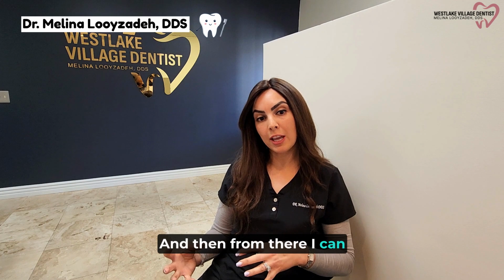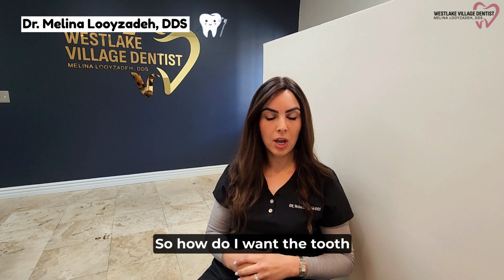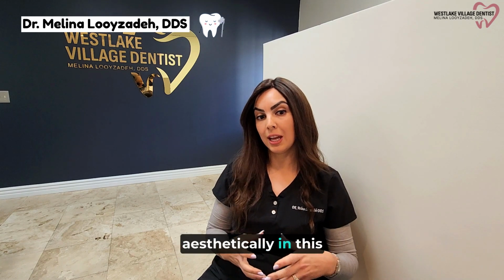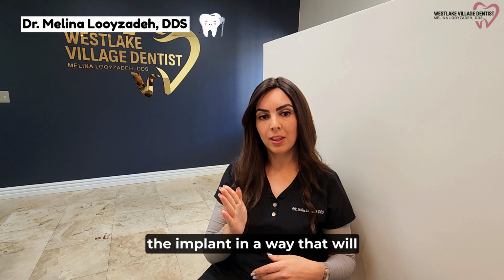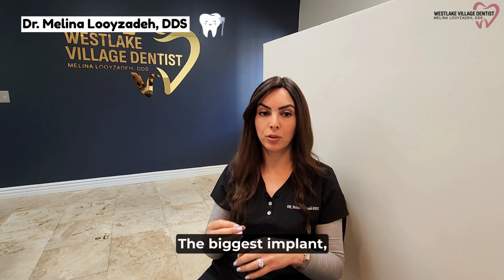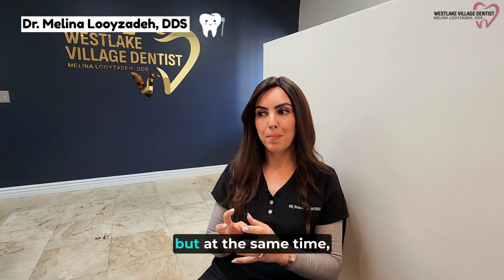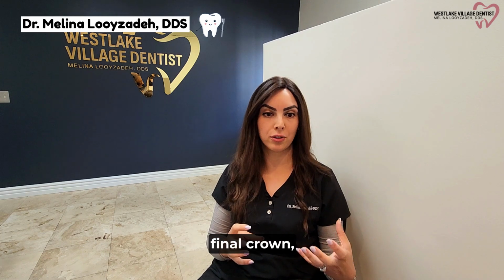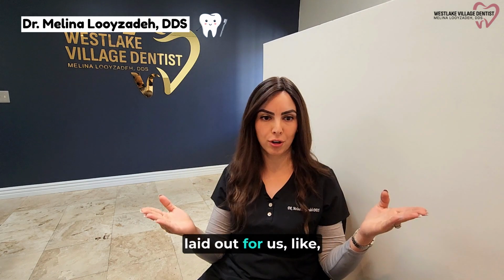And then from there, I can use the same program, the same imaging, to plan that out. So how do I want the tooth to look? Okay, well, I want the tooth to look aesthetic in this area in the mouth. It will plan the implant in a way that will optimize how well the implant is placed, the biggest, the widest implant that works in that area. But at the same time, it makes the aesthetics of the final work, the function of that final crown, a lot easier to determine because it's all laid out for us, right in front of us.